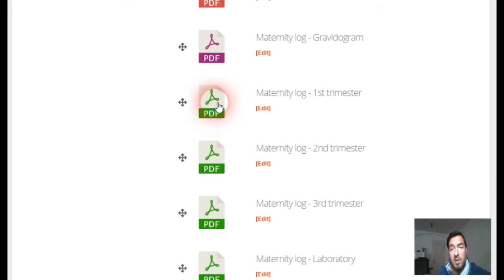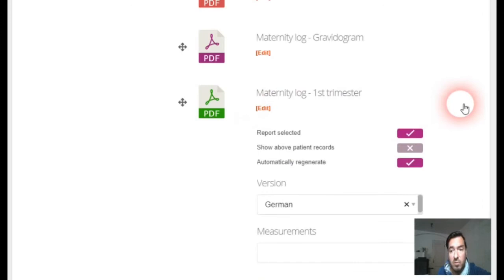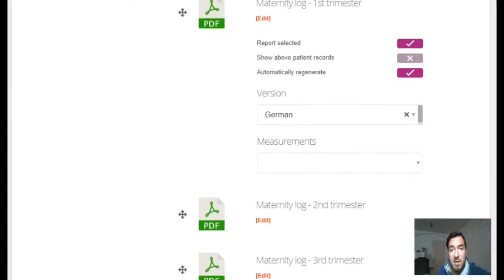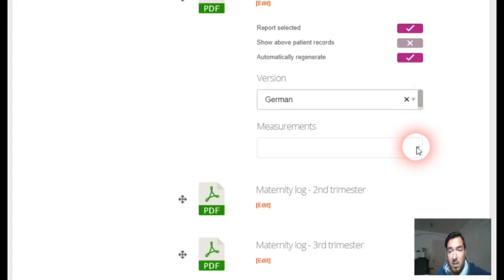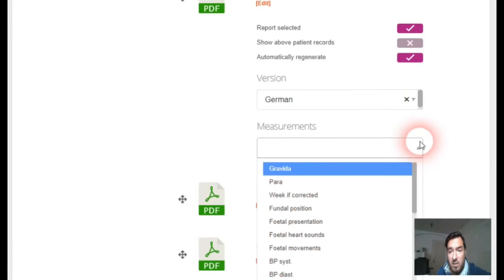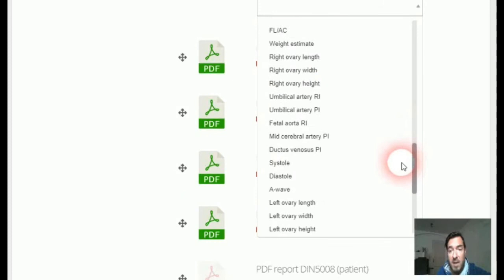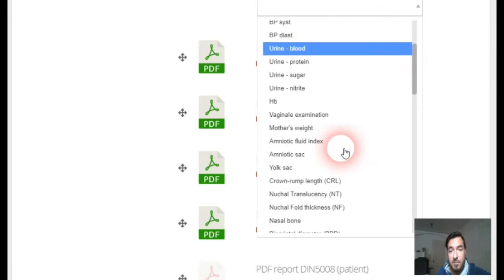All these things can be generated automatically. In the settings of each report you can also choose what to display — for example, in the maternity log first trimester settings you can select the version: German or Austrian. The German one is a little bigger; the Austrian one is a smaller notebook. Most importantly, you can choose which measurements you want to display in the maternity log, and you have all possible options here.